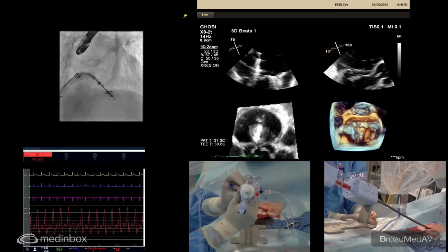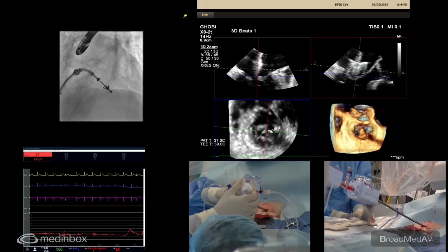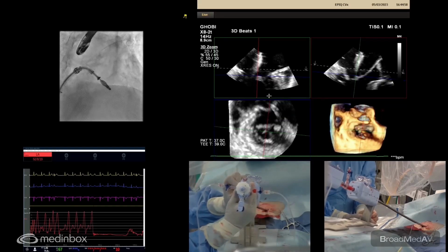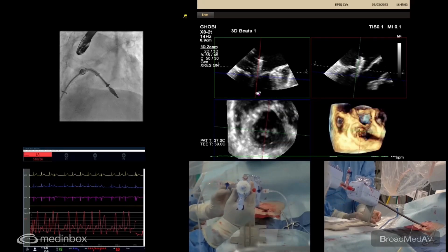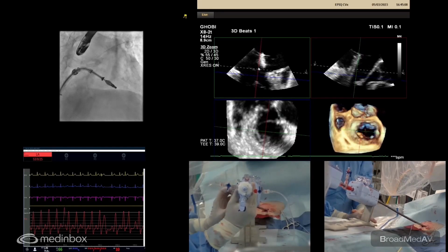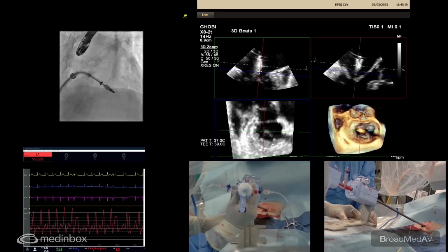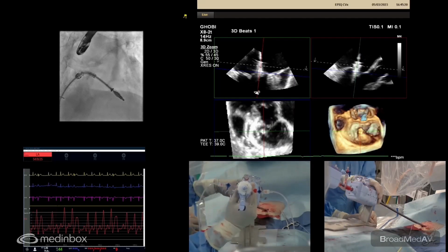So I went a lot medial, right? You're right on it. All right, I'm going to close the clip now completely. And I'm going to slowly dive inside. Let's watch that medial dive. I'm going to straighten it out a little bit. I like your location very much. Looks good.